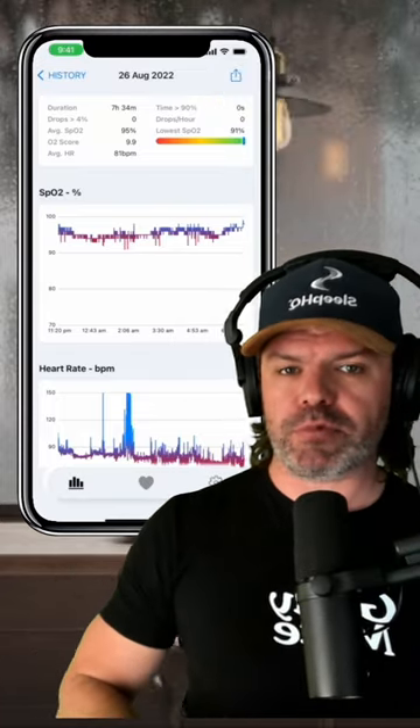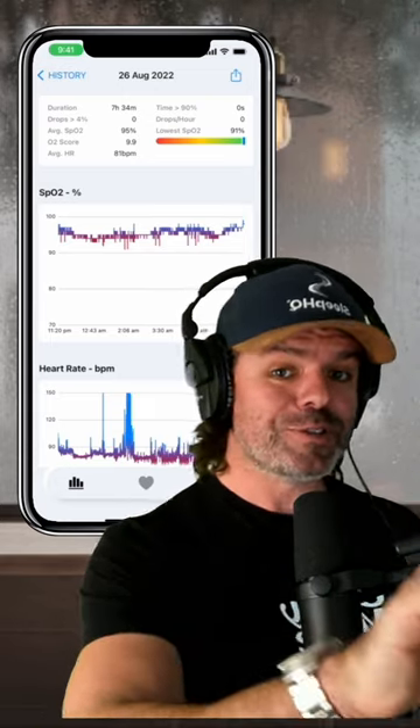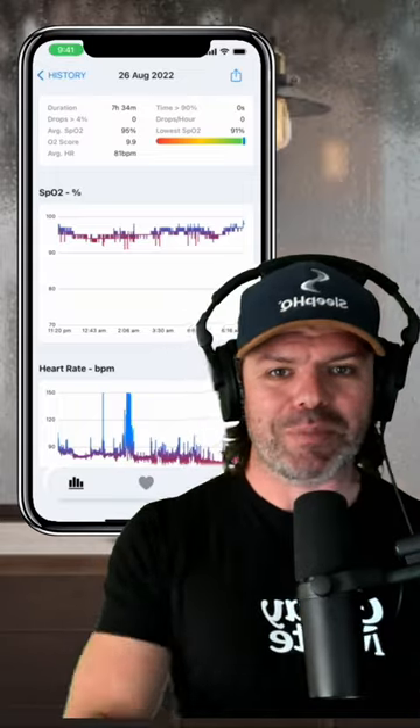You can use our brand new iOS app for free to sync it via Bluetooth to view your O2 charts. Now if you want to sync it wirelessly with your Sleep HQ account, you'll need a pro membership.